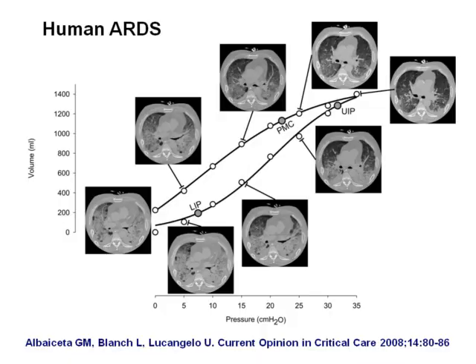Furthermore, we know that if we need to apply PEEP, we need to understand the relationship between pressure and volume in static conditions. So many ventilators provide a tool to draw pressure-volume curves in a static condition. And if you look here, as soon as we increase pressure, we also increase volume, and the lung starts to be recruited. And there is recruitment over all this pressure-volume curve, but of course here there is also overdistension. And then on the way back, you will see that for the same pressure, here for example, there is much more volume in the lung.